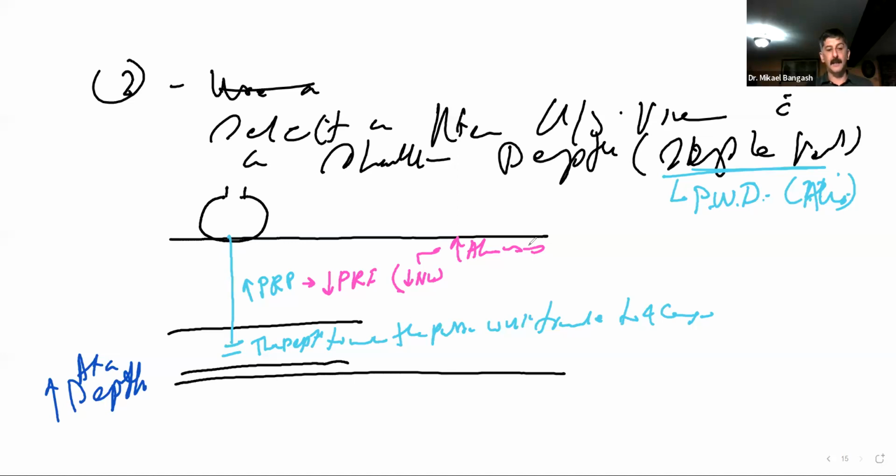But here, ladies, we are not turning any knobs on our keyboard to fix this. What we mainly say is, this blood vessel here is all dependent upon the angle from which we scan it. That's going to be a great distance between the transducer and the blood vessel. Did that make sense?